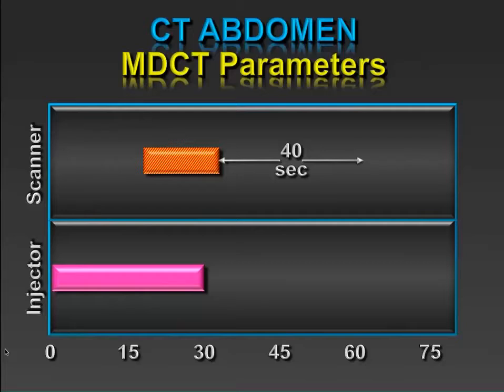That's actually a misprint. That should be about 12 seconds later for the non-cirrhotic patient and 15 to 18 seconds for the cirrhotic patient for that scan. And then we simply do an abdomen through the iliac crest during a single breath hold, which is on the order of 2 or 3 seconds for most multi-detector scanners.